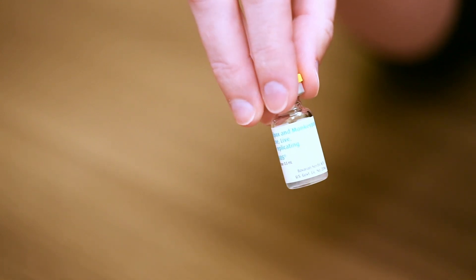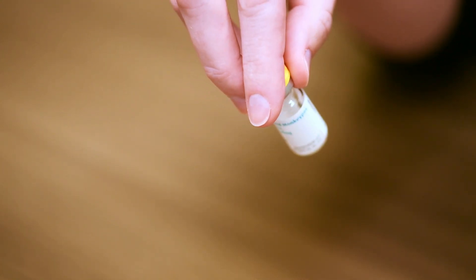Step three: with the vial upright, gently swirl the vaccine for 30 seconds before withdrawing a dose.